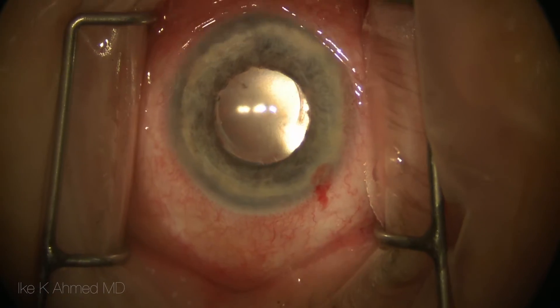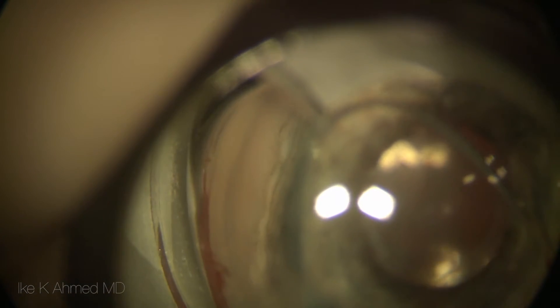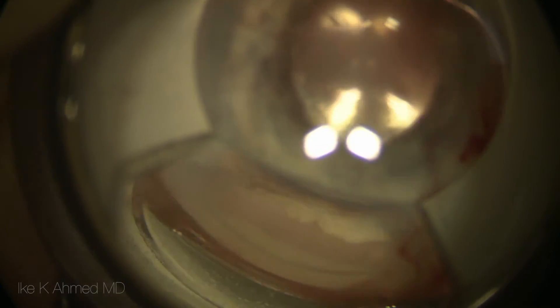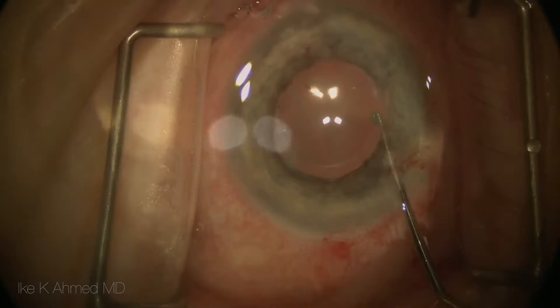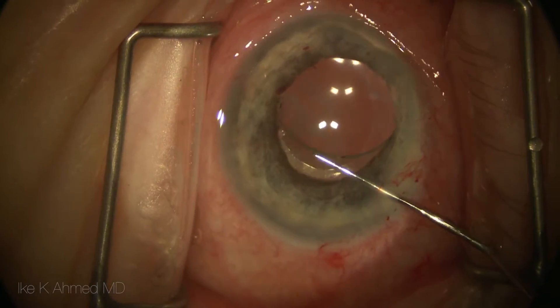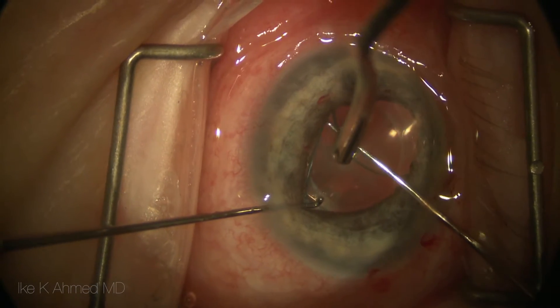This 17.5 nanophthalmic eye has had piggyback lenses and, as a result of these lenses in the small eye, has developed chronic angle-closure glaucoma with a significant amount of peripheral anterior synechiae present and a shallow anterior chamber. The total power of these lenses was over 40 diopters, and in this case we're going to explant both lenses using two hooks.